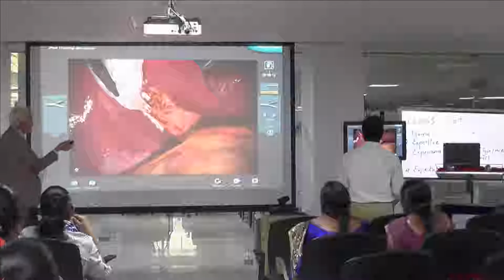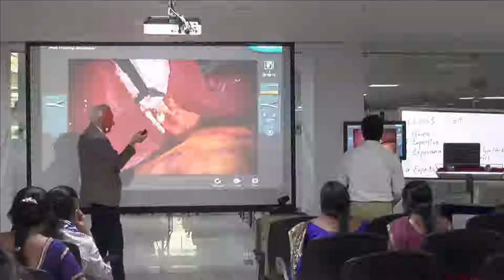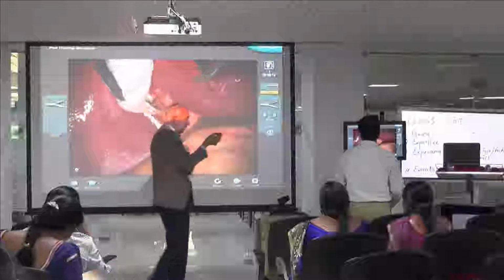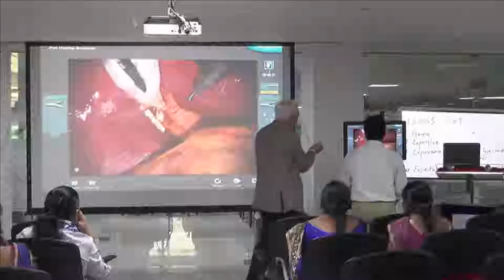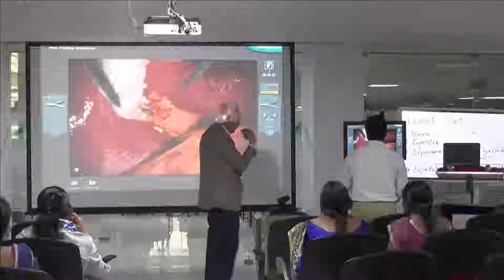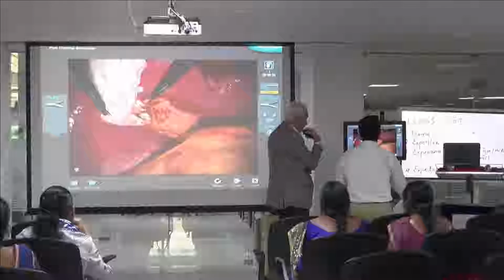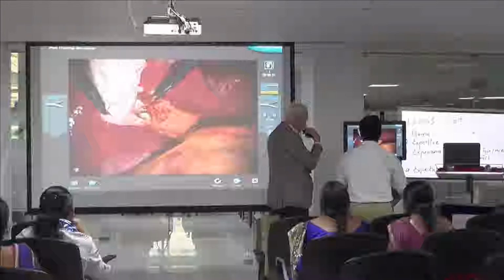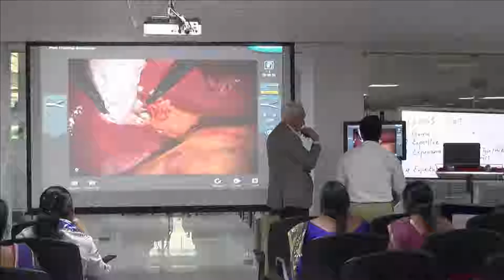So now I would ask the trainee if he is happy with the length of the structures and if the view of the critical view of safety is according. So what do you think about your dissection? Yeah, that's a good idea still to improve it there.